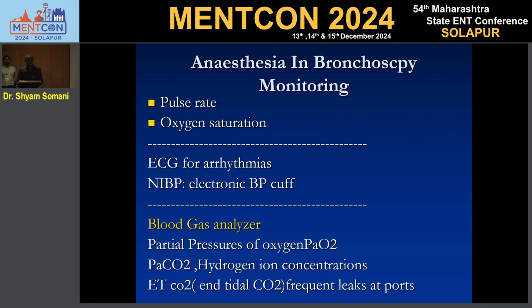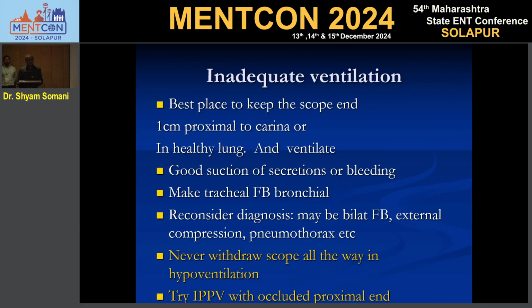And the rest of the monitoring, blood gas analysis and those things. Now, inadequate ventilation during scopy is an issue. Both should have a very calm mind. You should have an anesthetist who is well versed with your technique and your OT, and who is doing these types of procedures all the time.